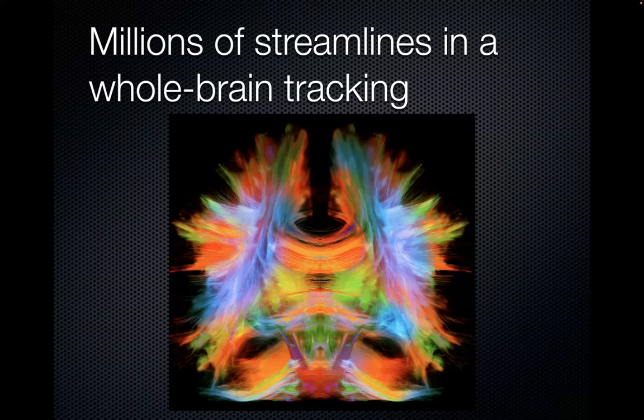First, are they connected? Maybe the first question is binary, 0, 1. And then unfortunately, because this was invented 20 years ago, in network neuroscience at the beginning, all people could use is, okay, yes, no, they're connected. Then what do I put in the matrix? People put the average FA in the matrix.